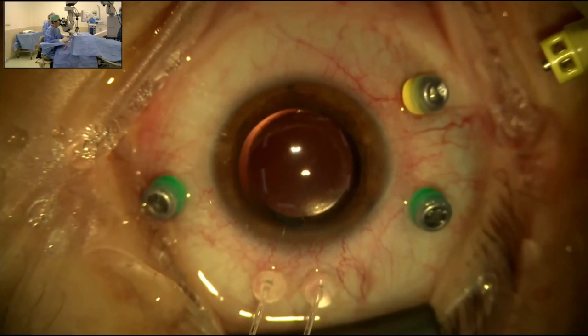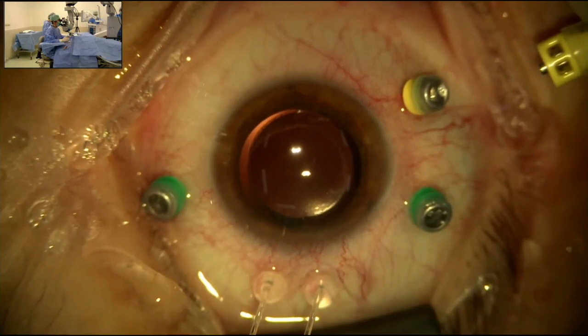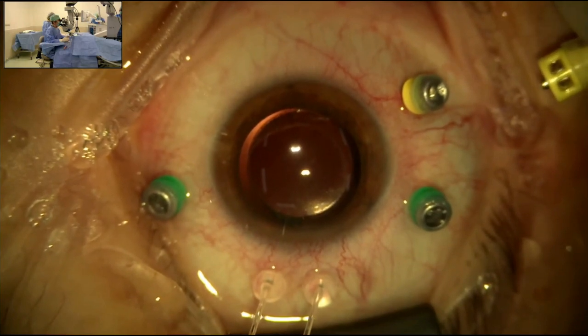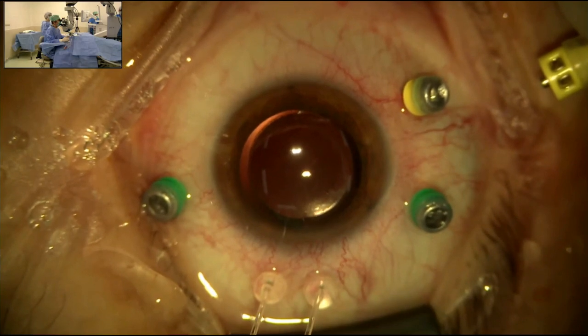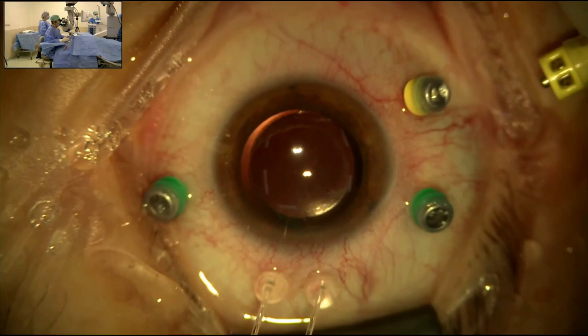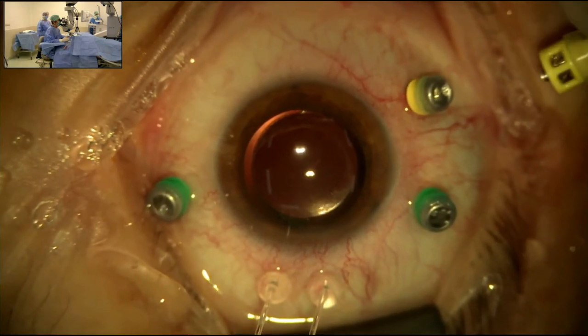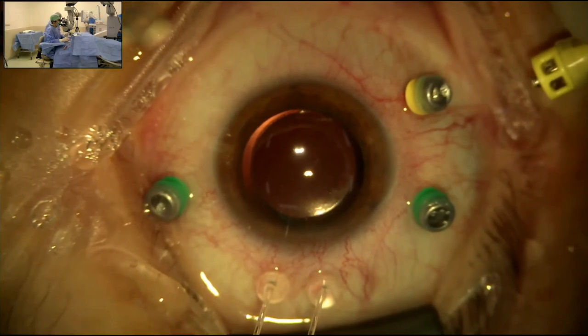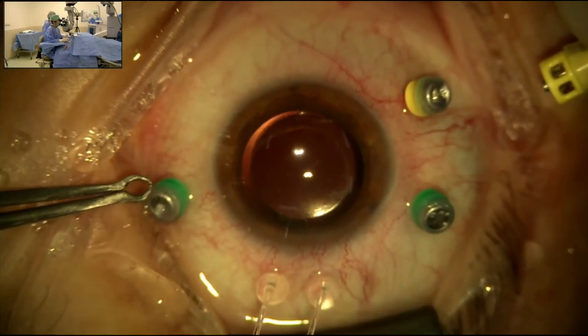Okay, thank you. Good morning, everyone. Today, I will do a surgery with a fresh retinal detachment case, a pseudophakic case. There's a large tear on the superior quadrant and also macula-off retinal detachment. So this is our regular setup for retinal detachment surgery.